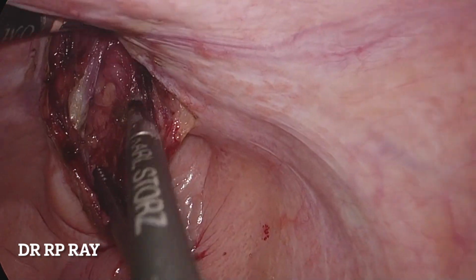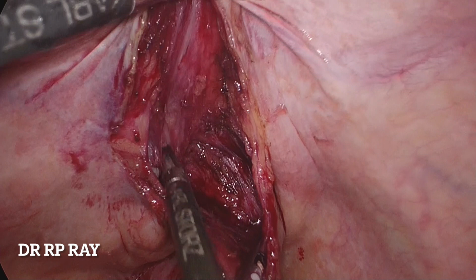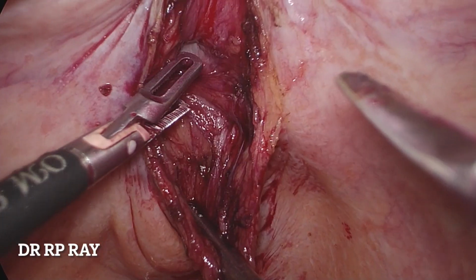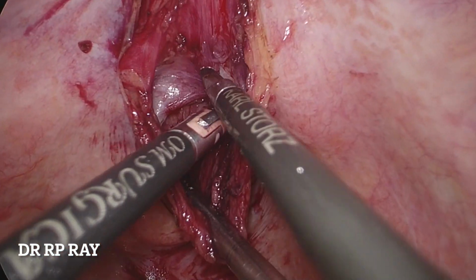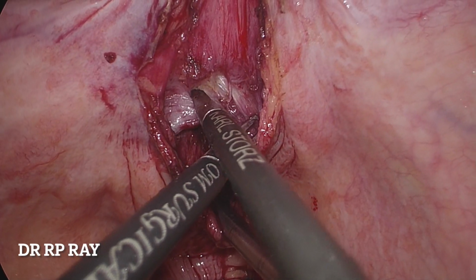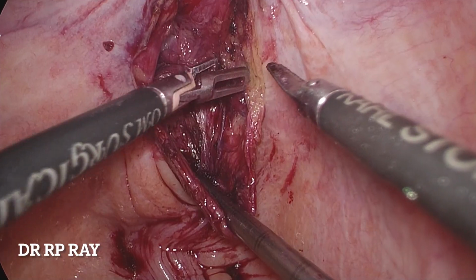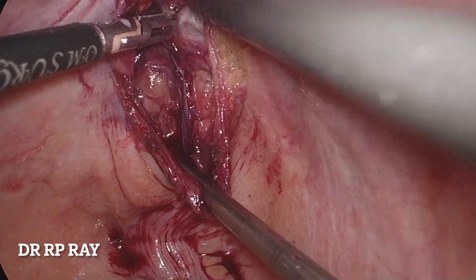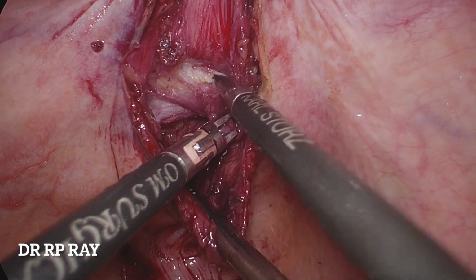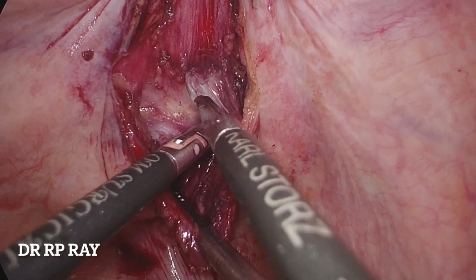There may be some small bleeding that can be cauterized. Here you can see the seminal vesicle and the vas deferens is identified, and slowly the fascial attachment from the seminal vesicle and the vas deferens are dissected out. The dissection is continued progressively to tease out the fascial attachment from the seminal vesicle and the vas deferens.